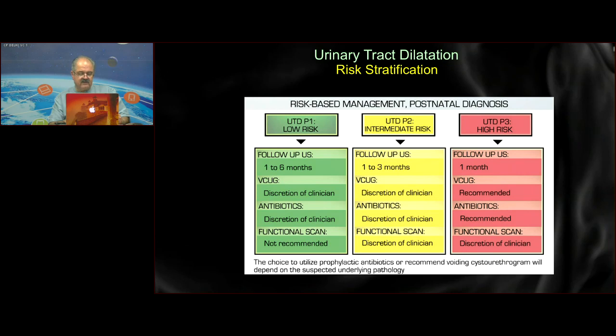Can we diagnose congenital adrenal hyperplasia in the antenatal scan? The fact remains that most abnormal kidneys will be seen as abnormal kidneys, but most abnormal adrenals will not be seen as enlarged adrenals. Yes, if you see a globular adrenal, unilateral, bilateral, you might be able to diagnose it in an appropriate background.